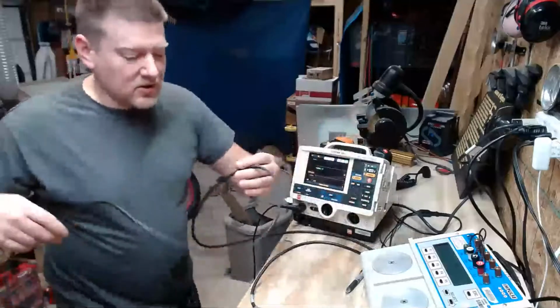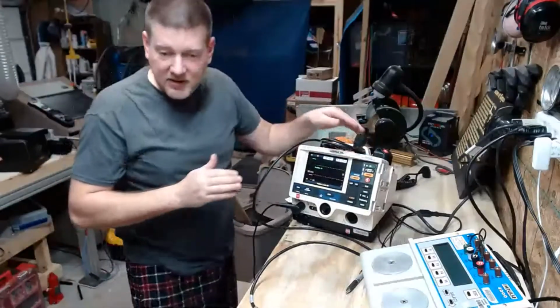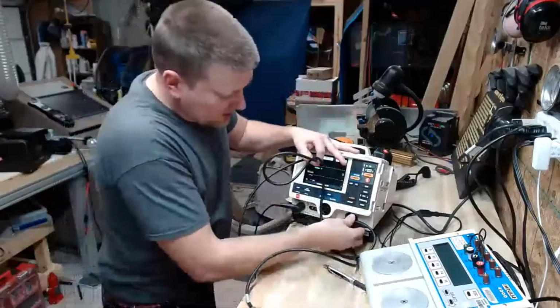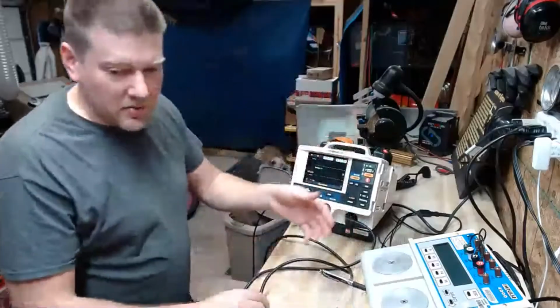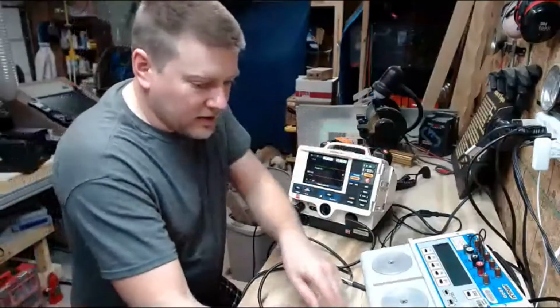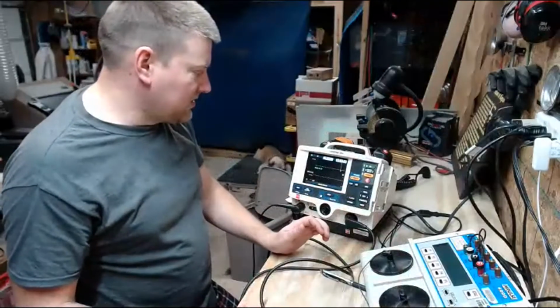When I leave a defib, I make sure that all the cables are done up nice and neat, tucked in where they need to be tucked in. It's especially important with defibrillators. They grab them and they just run, you know, they take off with them. All right, so let's put this guy back on so I can show you some of the other tests that we do.